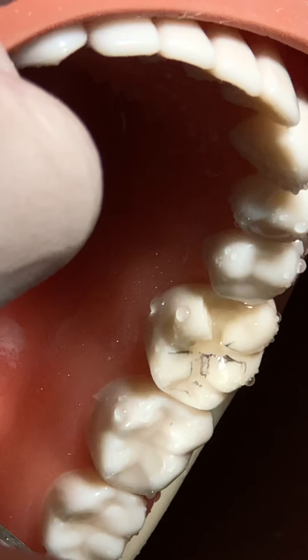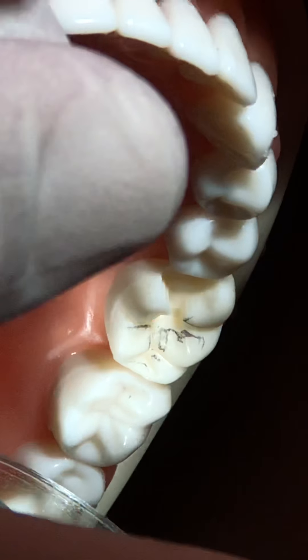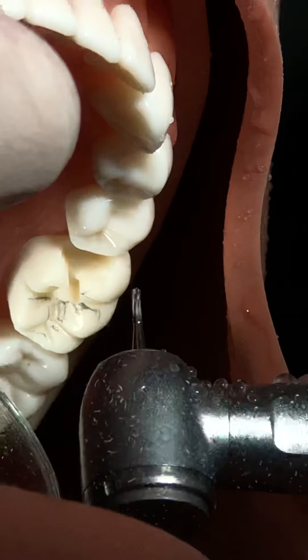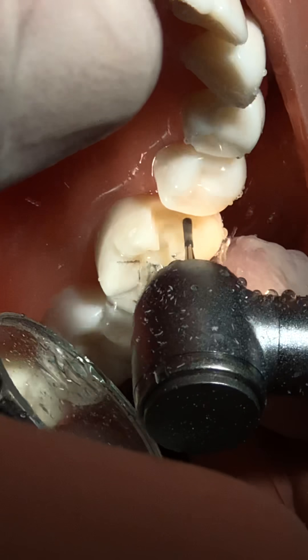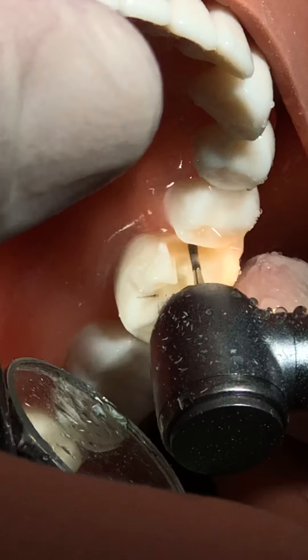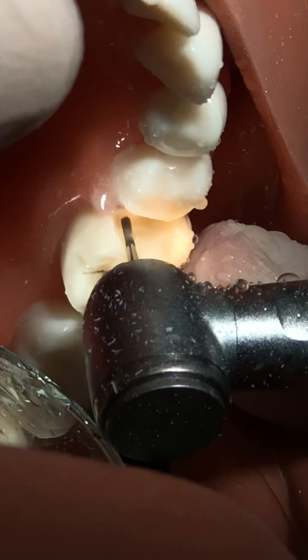We will check everything is good. The end of the blade prepares the gingival floor, the side of the blade prepares the buccal wall, the lingual wall, and the axial wall.